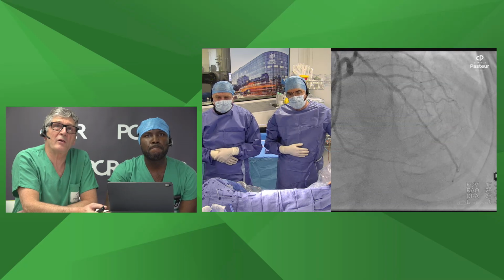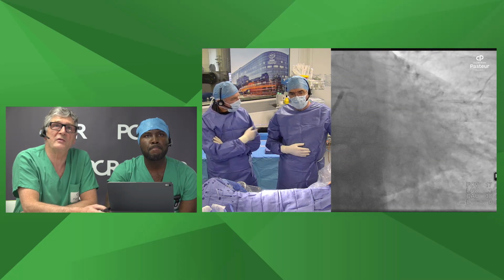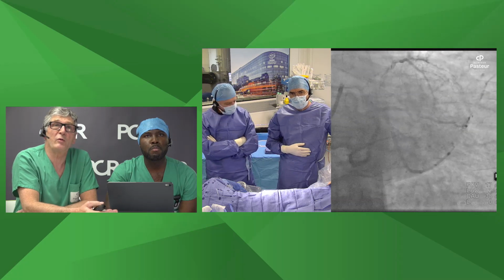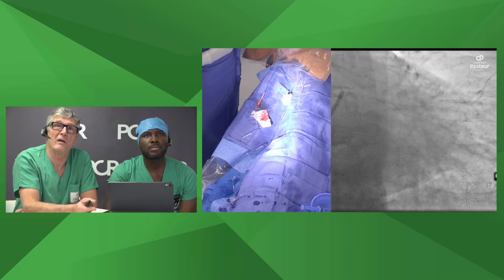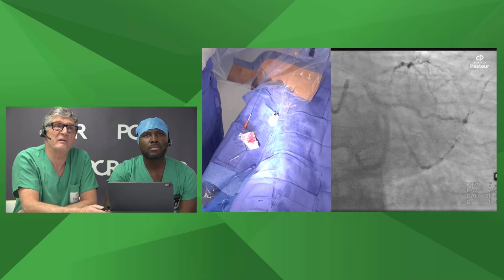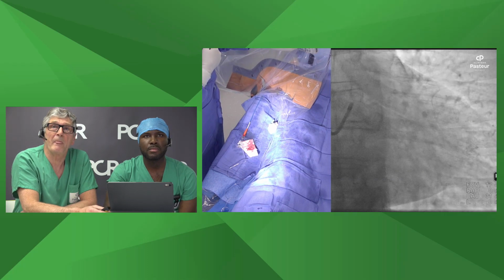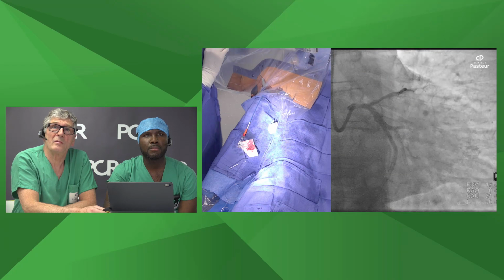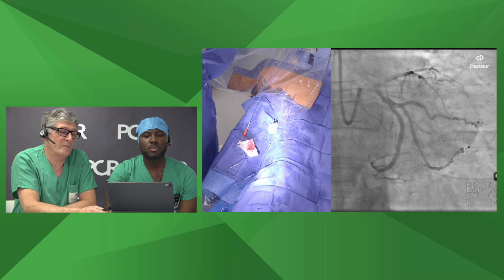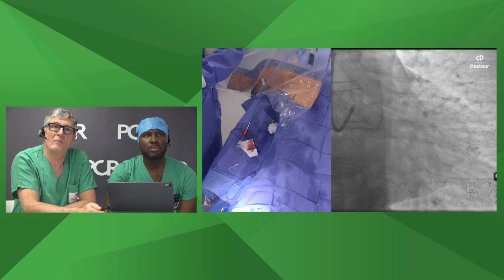I see that you are coming from the radial approach. So which kind of guiding catheter you are using, which kind of wires, and which kind of balloon for pre-dilatation? Because we have seen in these last images that there is some calcification of the proximal LAD and distal left main. Yeah, sure. And so Thierry, then you see here it's a 7 French XB 3.5 guiding catheter.